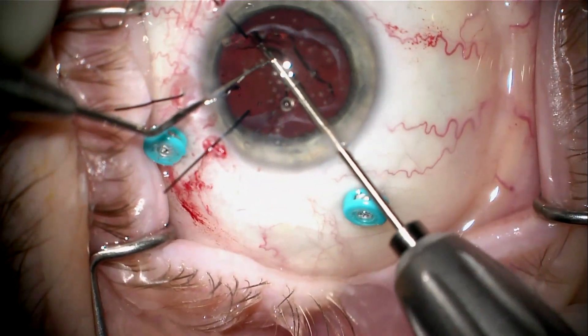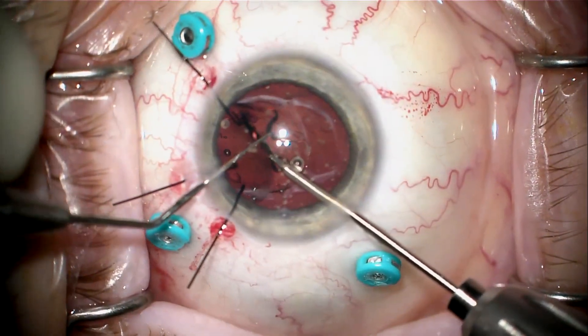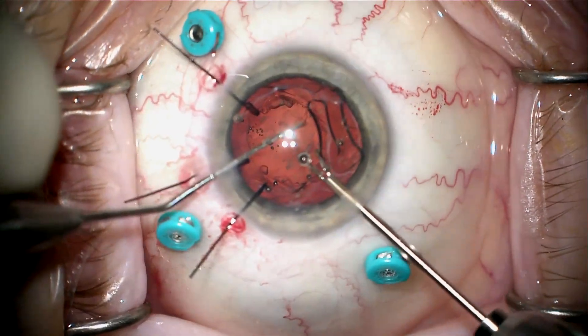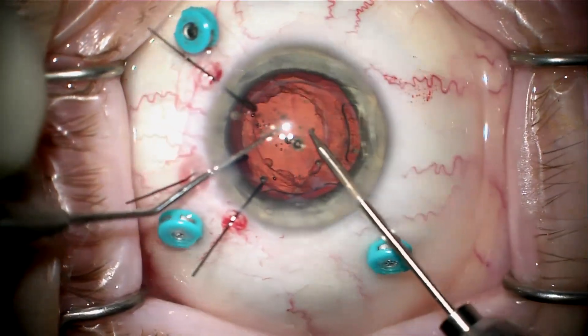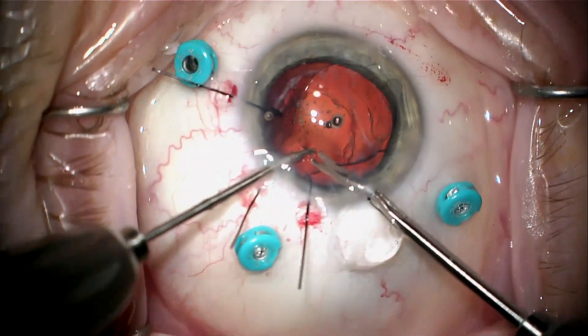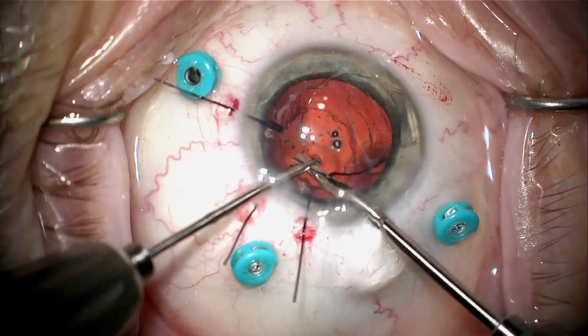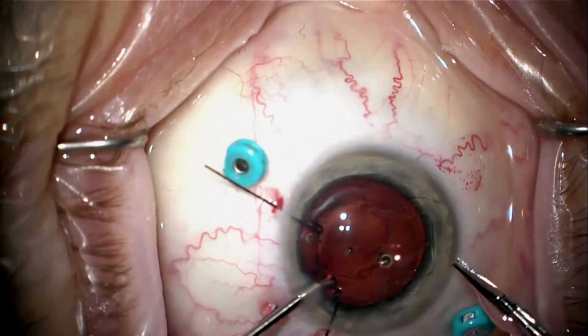We've been able to dissect most of that fibrosis away with the 27-gauge needle. We're going to bring this side of the lens up above the anterior capsule rim and the iris, and now I can go to the other side and cut the last haptic. This is freed up enough that I can pull this out and cut it right here with a scissor, so now I've got the lens up in the anterior chamber.